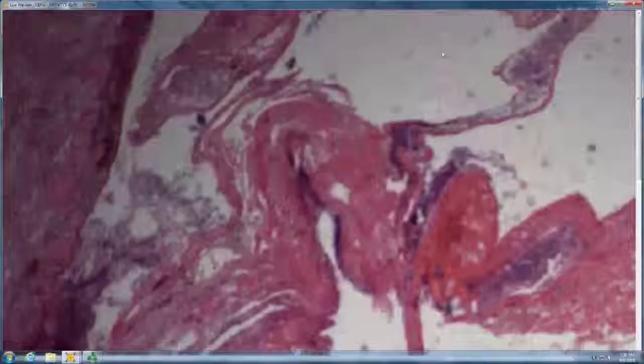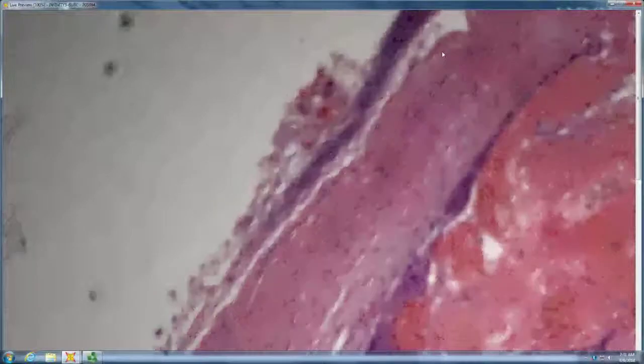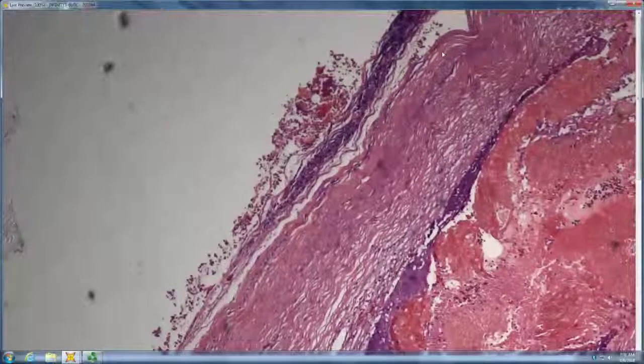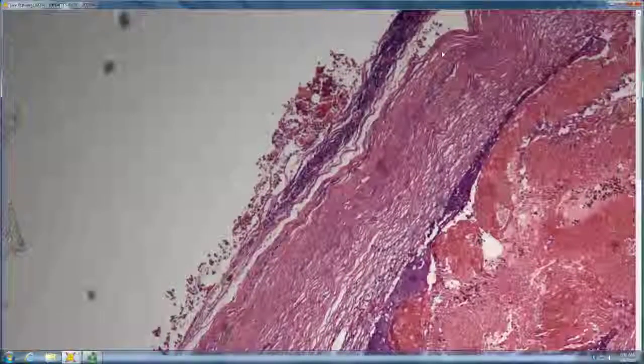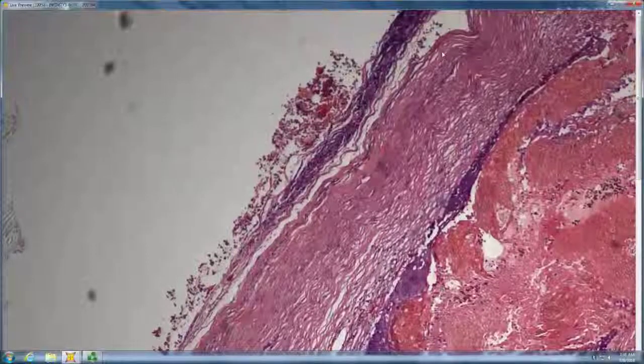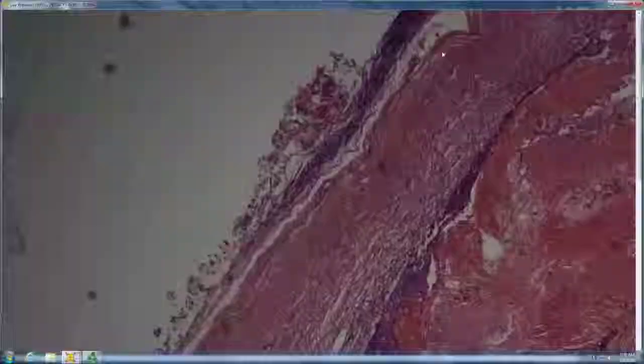So, Lindsay, here's a tumor. So I see some shadow cells, I think. So you have basaloid cells. First off, let's get ourselves in focus here. Basaloid cells look like they're turning into pinker cells that are shadow cells. Looks like it's pretty well circumscribed.